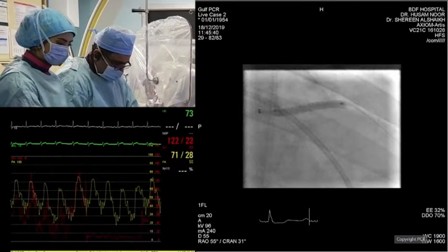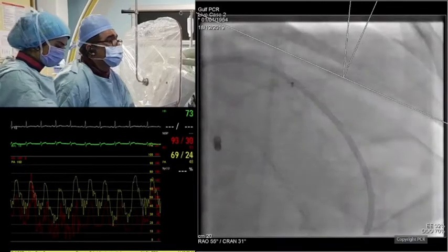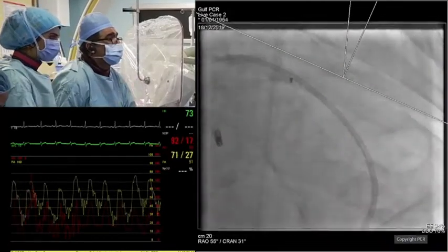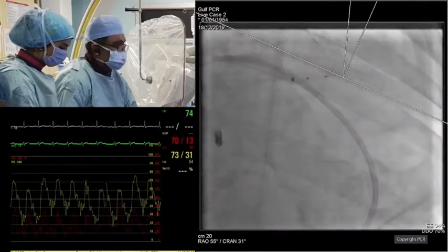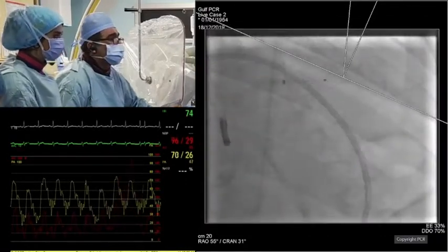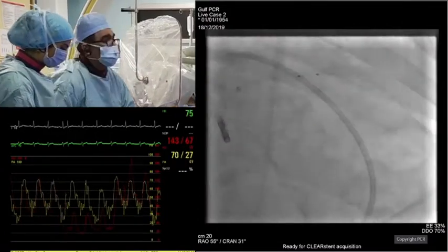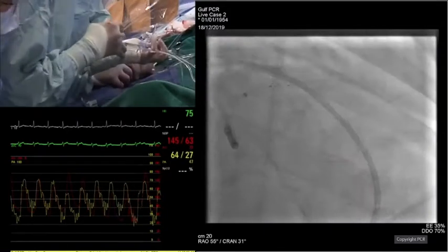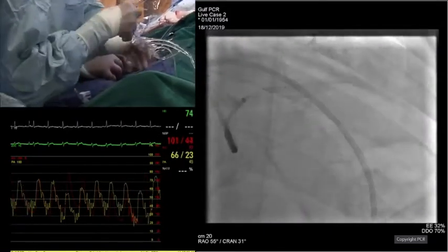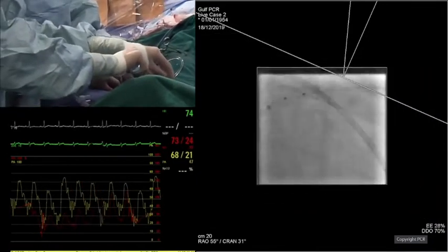So even using the 4-0 balloon proximally is guided by the OCT image, as you remember. It was around 4-0 proximally and 3-0 distally, and it's a 3.5 balloon stent, as I remember, right? 3.5-48. Yes, 3.0-48. And again, the same problem is that's a 4-0 balloon. Stent boost. Yes, it is.